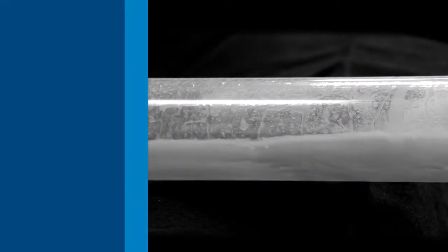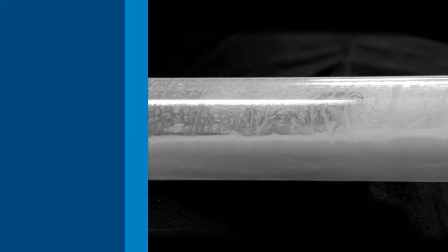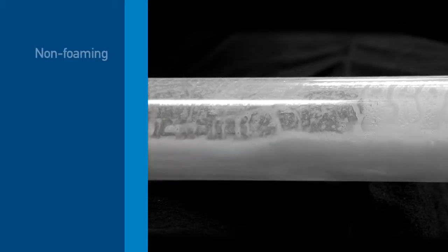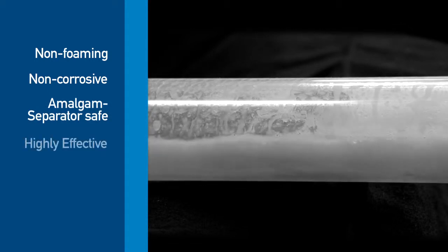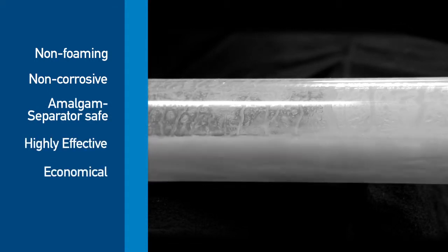To choose the right evacuation system cleaner, check for the following characteristics: non-foaming, non-corrosive, amalgam separator safe, highly effective, economical, and biodegradable.